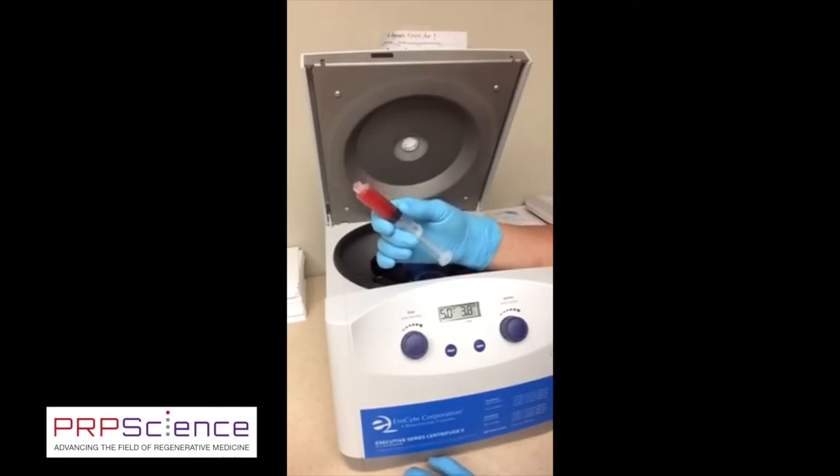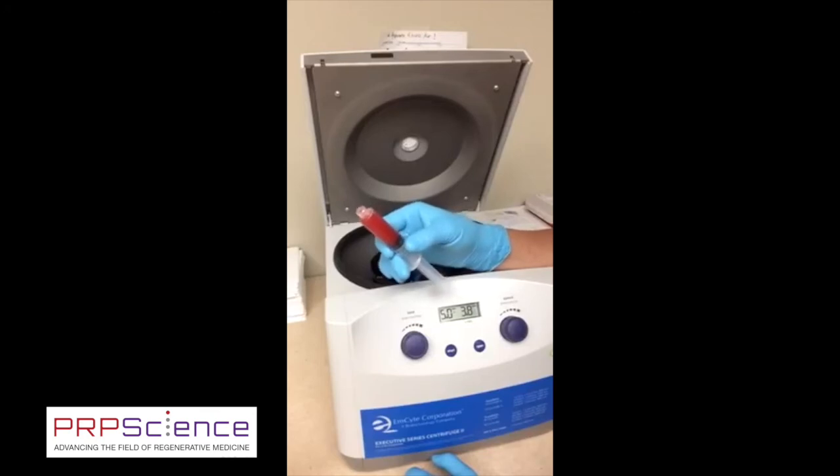Now, when we do rejuvenation or regeneration type procedures, regenerative procedures, we're injecting this platelet-rich plasma into a non-injured tissue. For instance, when we do an O shot or a Priapus shot. So I have to activate my platelets, and I do that with calcium chloride or calcium gluconate. I prefer the calcium chloride, but I always have some calcium gluconate on hand in the event that I have some trouble getting the calcium chloride. The calcium gluconate doesn't need to be refrigerated and has a much longer expiration date as a result. So anyway, I add about 5% of the calcium chloride to my platelet-rich plasma just before I inject. So I'm activating the platelets so that they spill their growth factors.